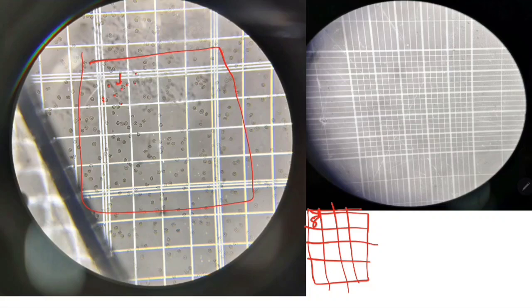Okay, next box, 1 2 3 4 5 6 7 8 9, so 9 we can count here. So likewise, and this one also we can consider. If you are thinking that this is touching the middle line, when you see it in the microscope, use the fine adjustment and you will get an idea. Because this is a picture, it's not clear, so that's why I'm considering that this maybe may or may not be, but this cell actually goes here. This cell will go in the center. 1 2 3 4 5 6, like that we go 1 2 3 4 5, and then count, and in total you will get the number, suppose 50 in this box.